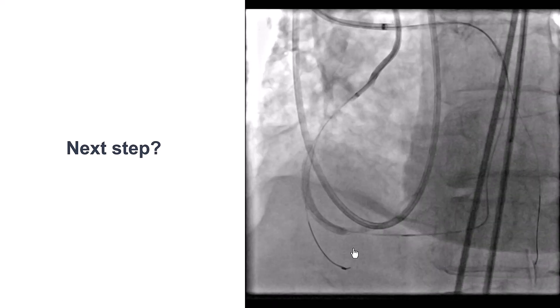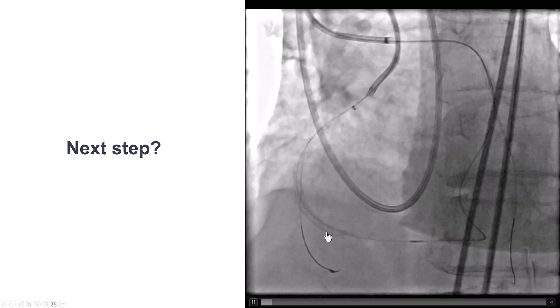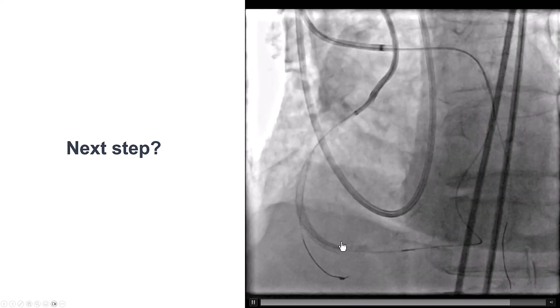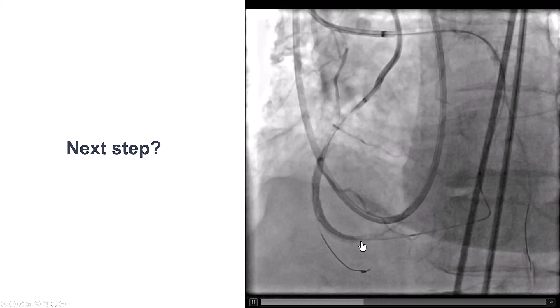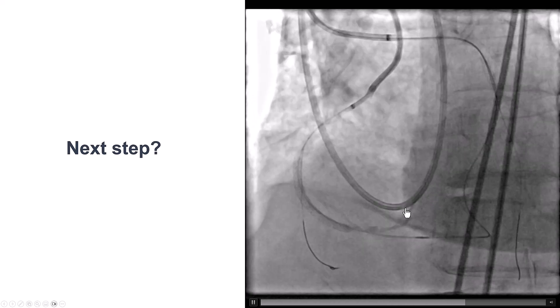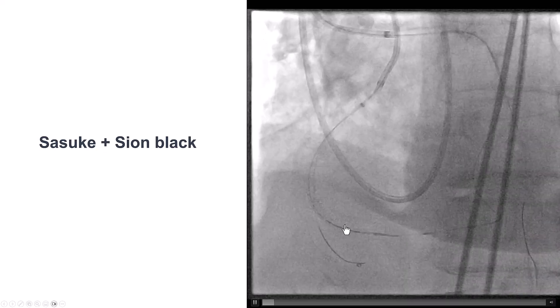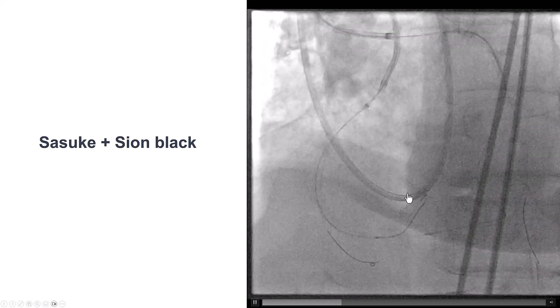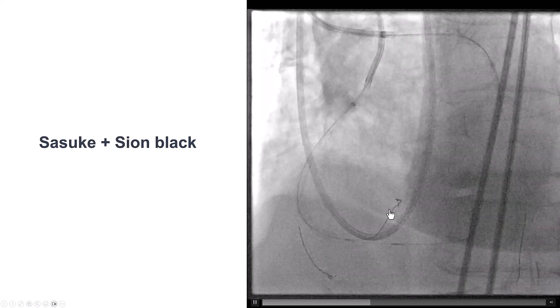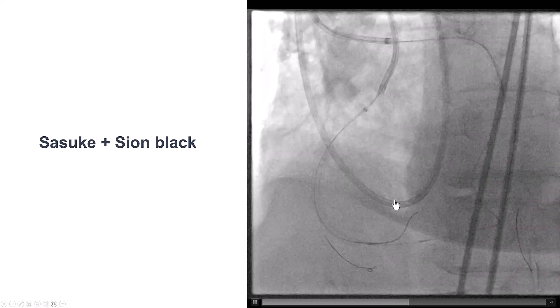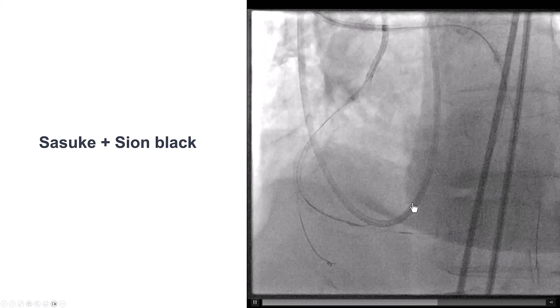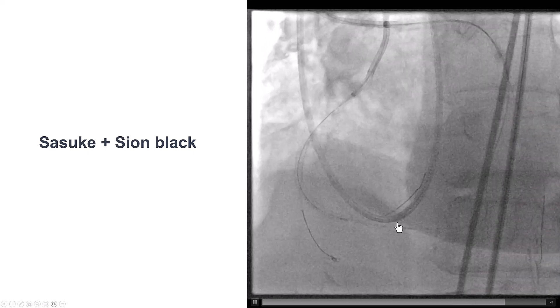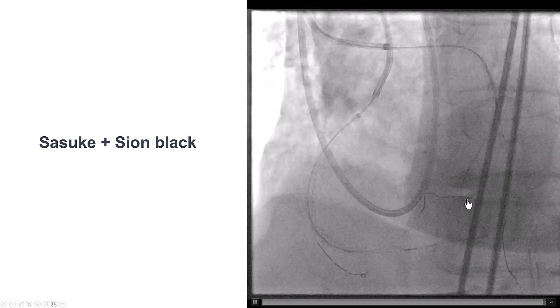This was quite frustrating — we had poor flow after putting the stent in. Looking at this more carefully, we thought there was probably some dissection further distal to the distal edge of the stent. We did have some filling into the right posterolateral. The plan was to advance another wire, so we used a Sasuke — a dual-lumen microcatheter. The wire was looping, and we tried to redirect it in multiple directions, pulled it back, and had difficulty advancing it until eventually the wire went further down.